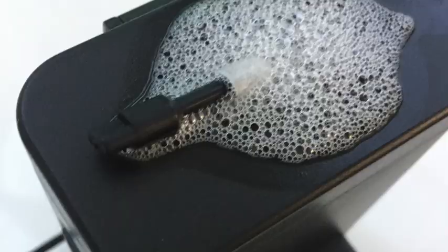The bacteria build up their numbers in the biofilm, and once they reach a critical mass, a critical number of bacteria, quorum sensing gene activation occurs. That means the bacterial population can sense when they hit a certain quorum or a certain density, a certain population number, and when they hit that number, genes turn on. And it's those genes that start producing the virulence factors that eventually lead to chronic inflammation of the lid margin. So that's why we have to throw those tips away, get the virulence factors off of there, and debulk the bacteria numbers down to turn off their quorum sensing.